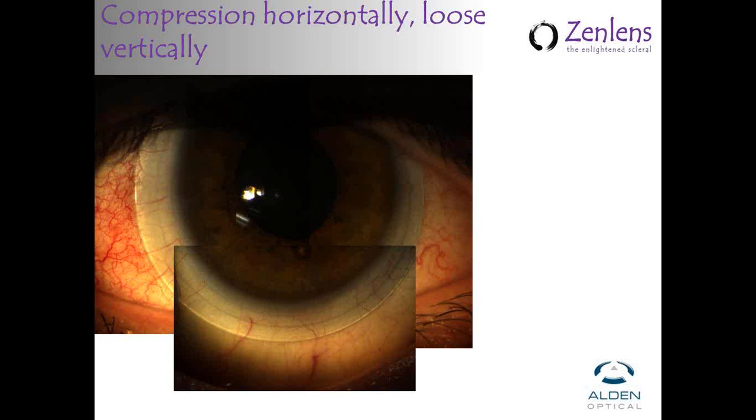Oh, that's a great tip. So it's just sort of like a diffraction, like when you stick a pencil in a glass of water, the image gets moved sideways. Oh, that's very interesting. Right.